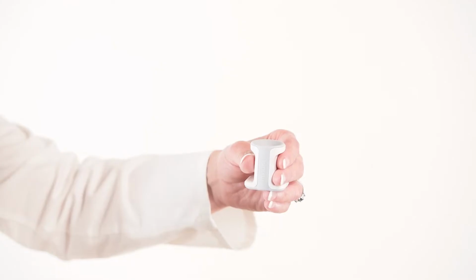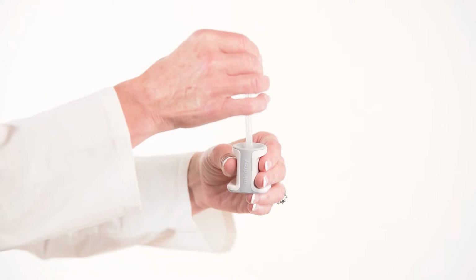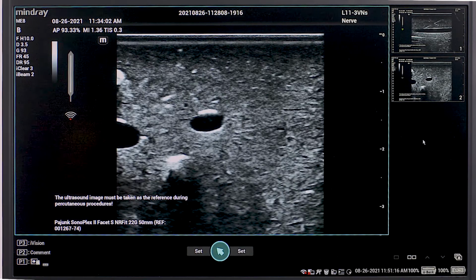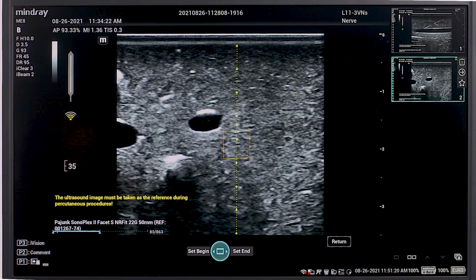Magnetize the needle by placing it in the magnetizer with the cap on, all the way to the bottom for a second, and pull back out. Notice the trajectory or dotted line on the screen before touching the patient with the needle.